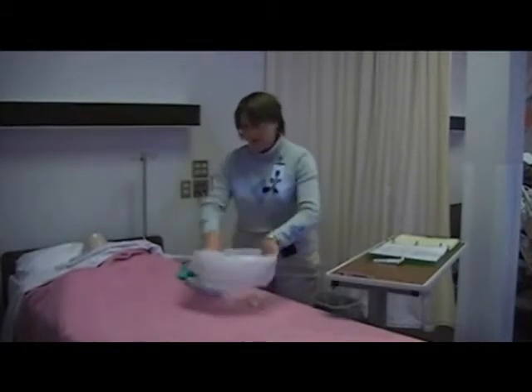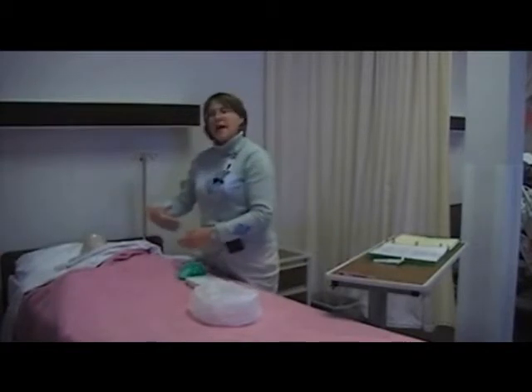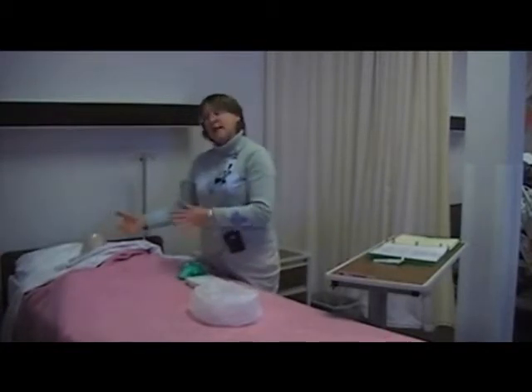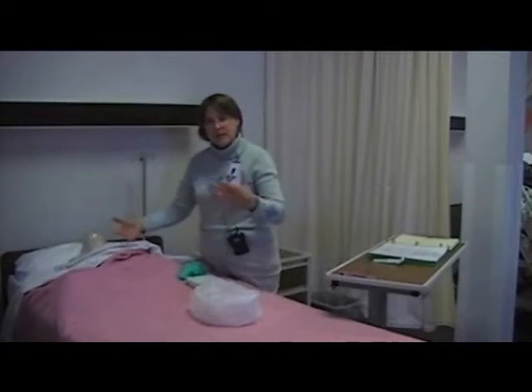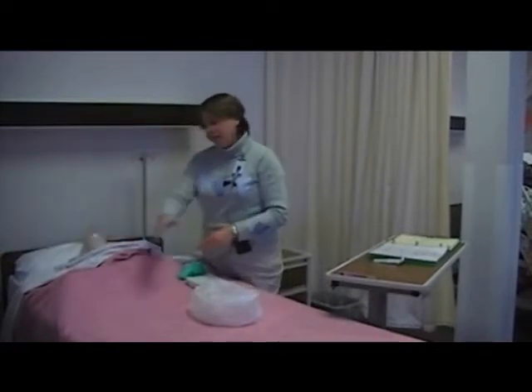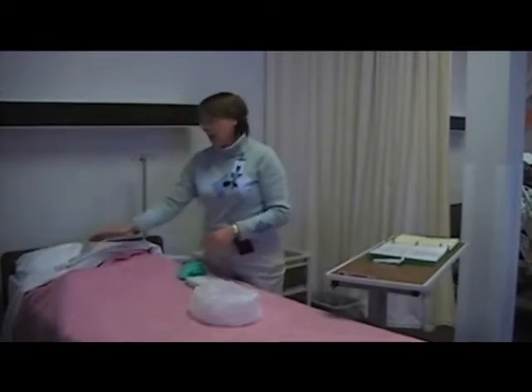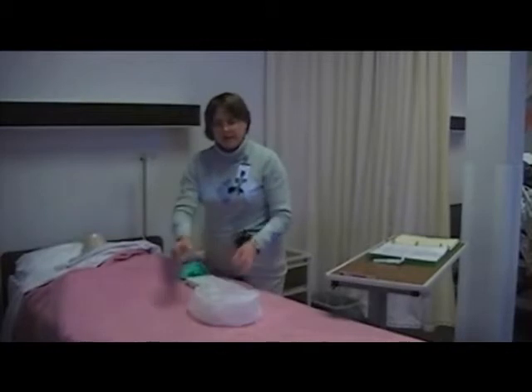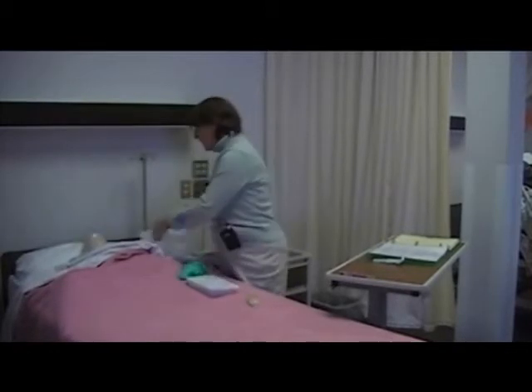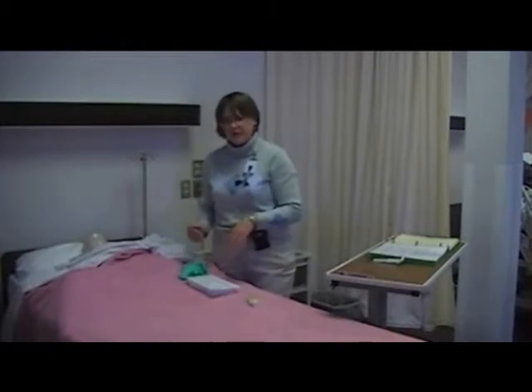Okay, so I've got my bag for discarding things. Now, I'm actually changing this on the opposite side of the bed than what I usually do so that I can project my voice a little better to you. If I dispose of my items down here, I'm going to be crossing over the sterile field all the time. So think very carefully where you want to set your bag so that you will not be crossing your sterile field.